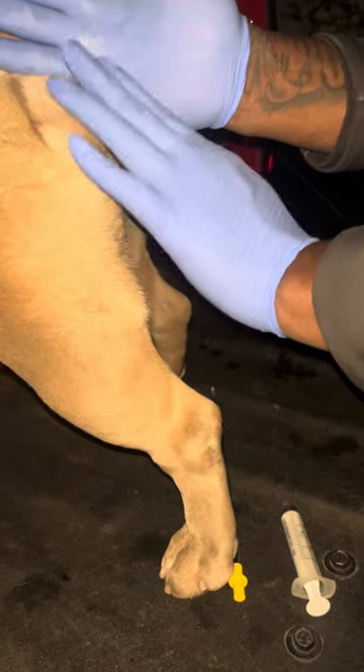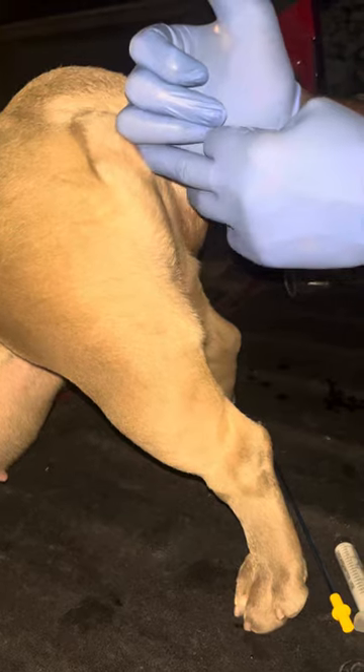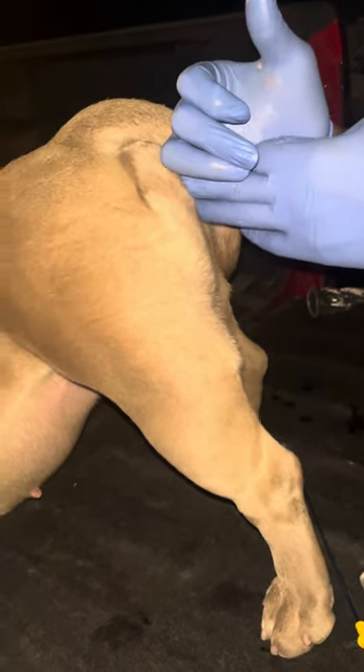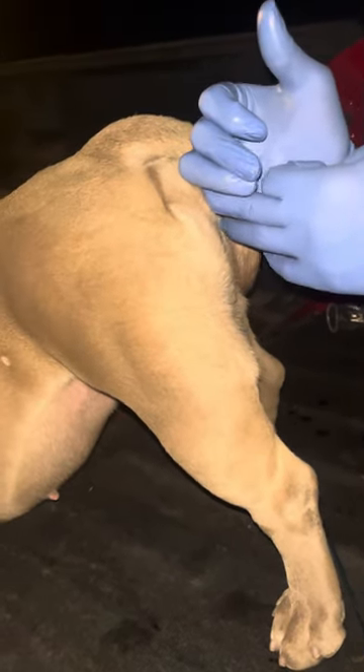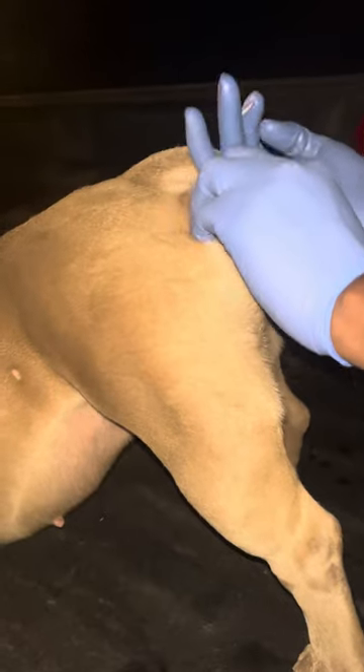Left is it. So where do you want to open it up? You just getting in there. You're going to feel a little hole at the end of your finger. Okay. Make sure you got gloves on. Yeah. There's guys out here that don't wear gloves to this. No, no.